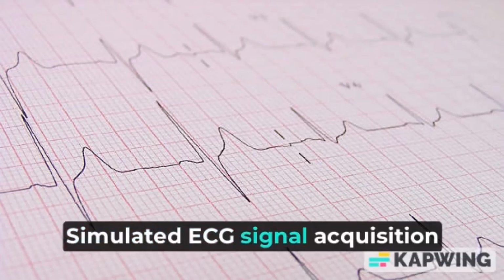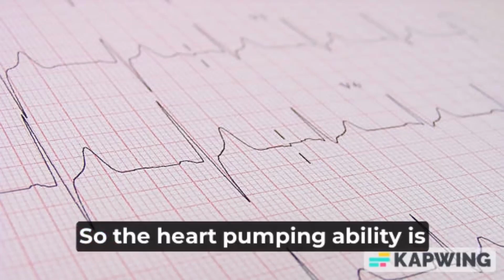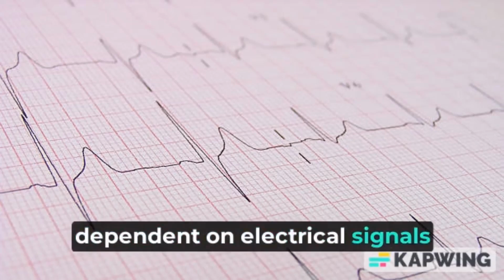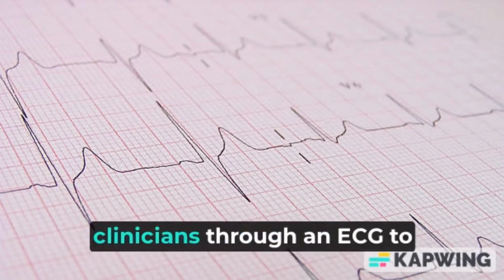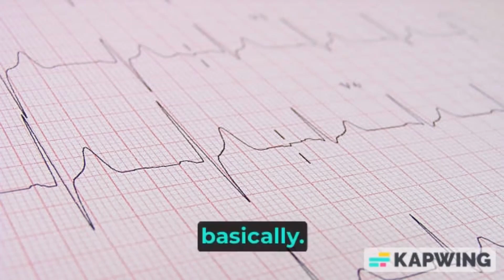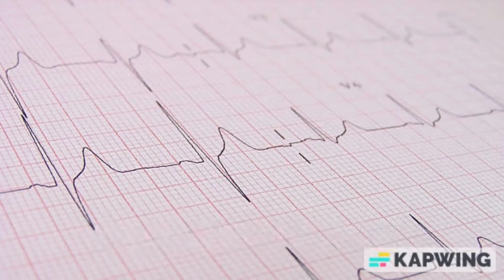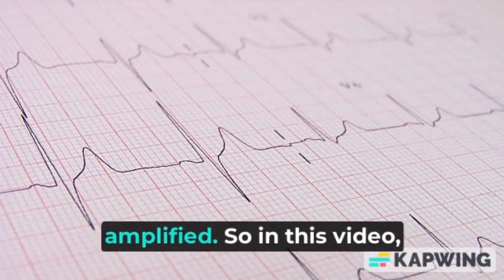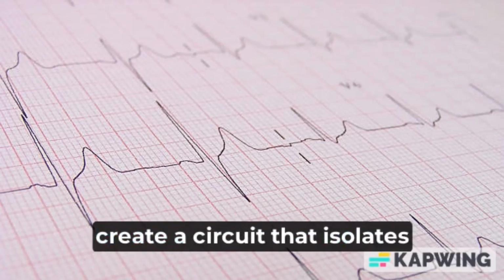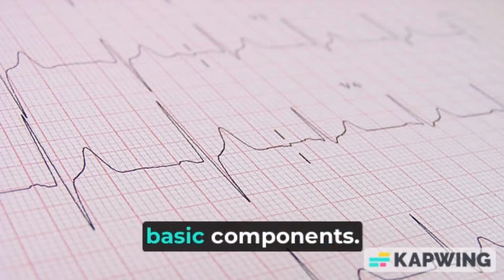Simulated ECG signal acquisition using the Proteus software. So the heart's pumping ability is dependent on electrical signals, which can be detected by clinicians through an ECG to identify different heart problems. Basically, if we want to accurately interpret the signal, it must first be filtered and amplified. So in this video, we'll demonstrate how to create a circuit that isolates ECG signals by using three basic components.